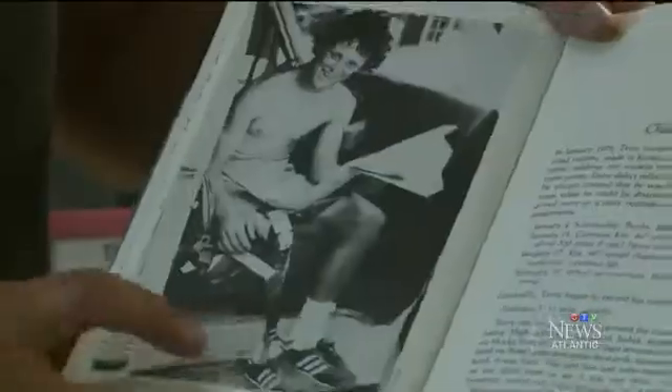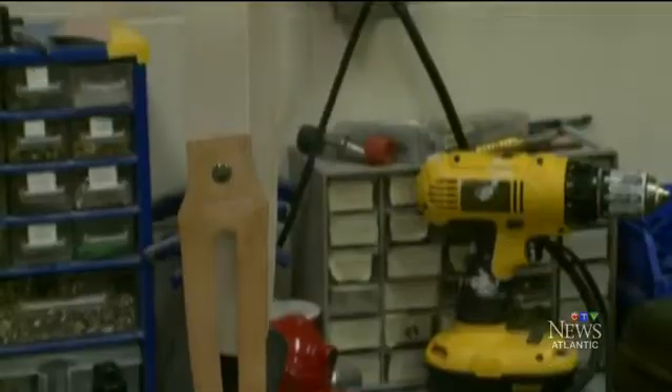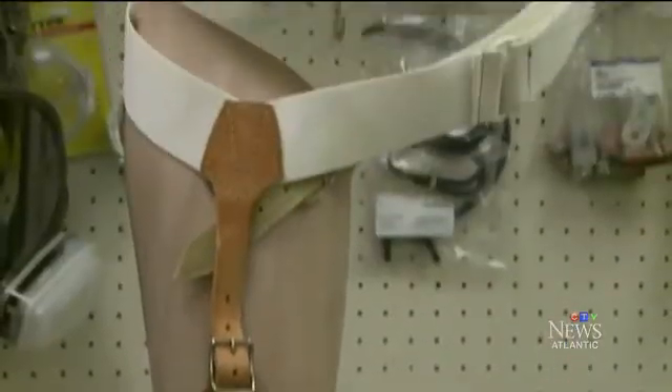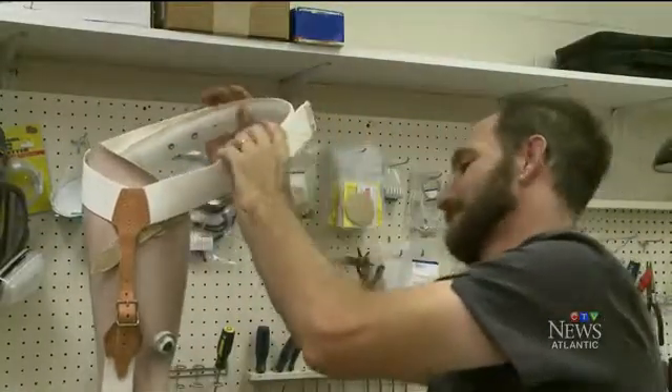It took Hoare about two months to put the replica together, with most of the time spent on research. The biggest challenge came in figuring out how Terry's prosthetic ankle was put together, because it was almost always covered by a running sock. The finished product is incredibly accurate — the result of painstaking measurements, tracking down discontinued parts, and factoring in the length of what was left of Fox's natural leg. Hoare even soaked elastic straps in buckets of tea to give the material an aged look.